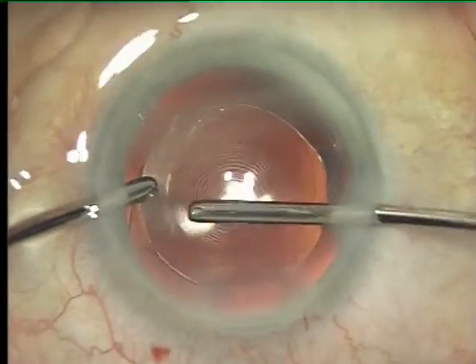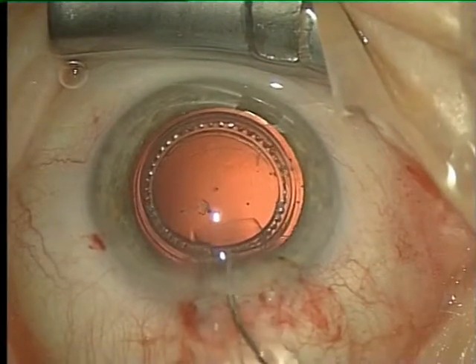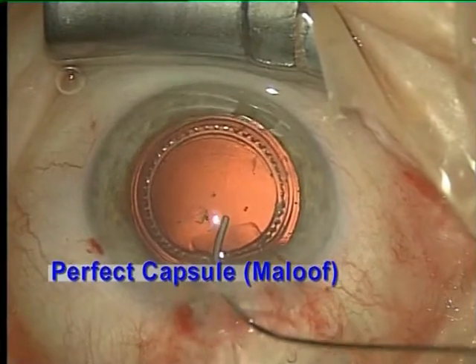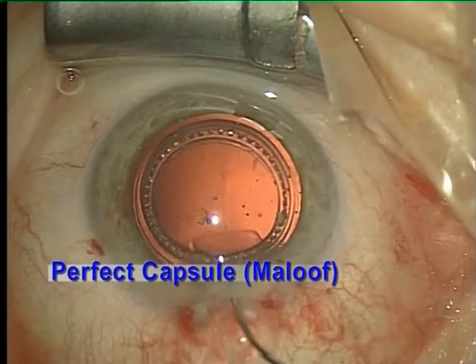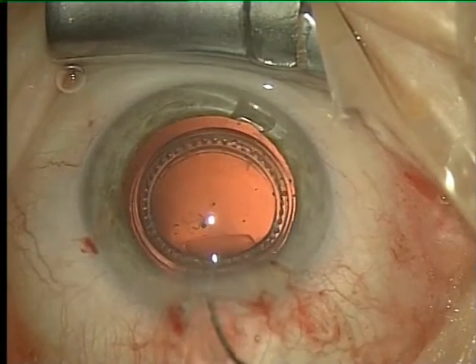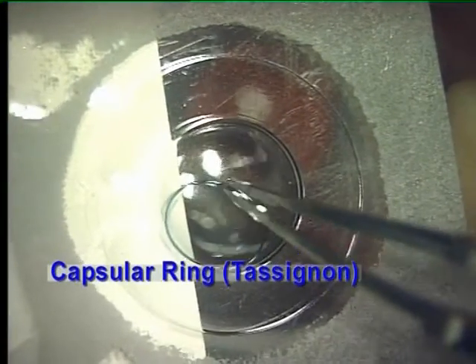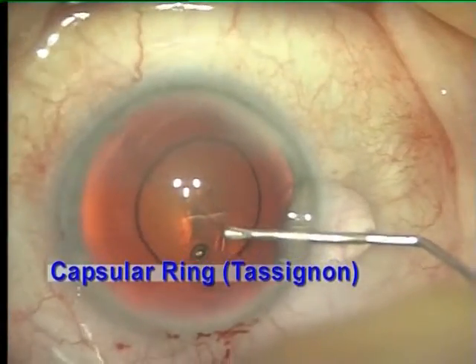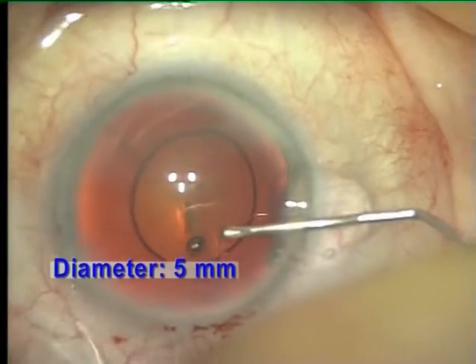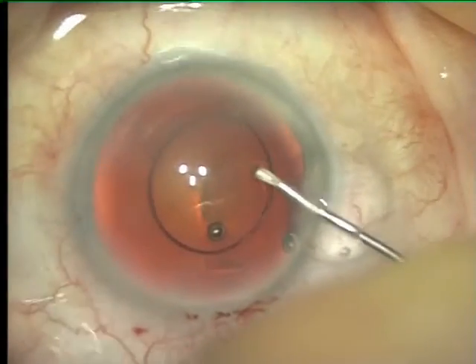For devices like the perfect capsule system, a well-centered 5mm CCC is required to attach its vacuum system to the capsule. Until now, several methods have been suggested to assist in achieving a CCC. The capsular ring is currently available in fixed sizes of 5 or 6mm. It is injected into the anterior chamber and removed after the CCC.